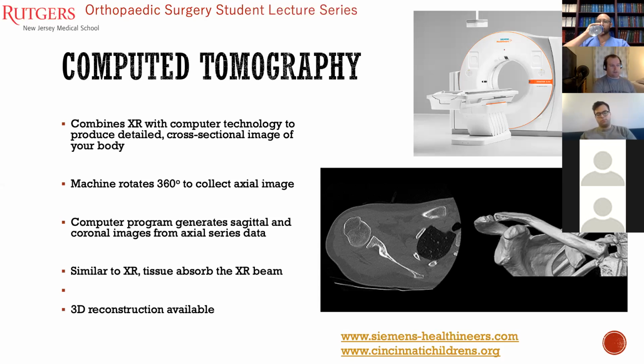Similar to X-ray, the tissues absorb the X-ray beam at a specific intensity related to the density of the tissue. So bone is white, cortical bone is the whitest, air is the darkest, and then soft tissue is somewhere between. Again, this gives you a 3D image in the sense that you have axial, coronal, and sagittal images that you're able to piece together.